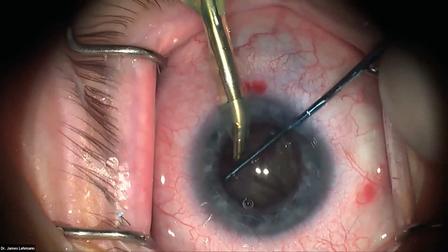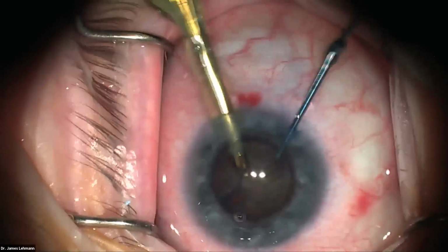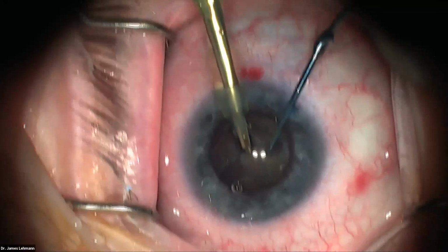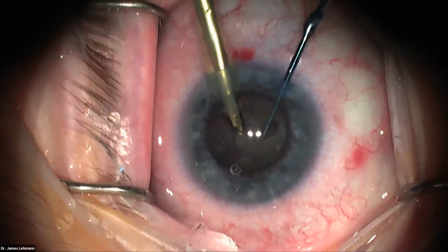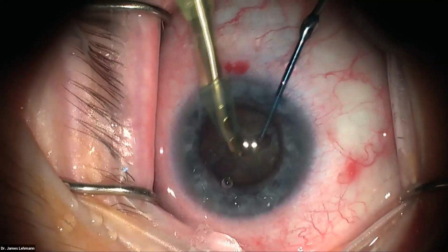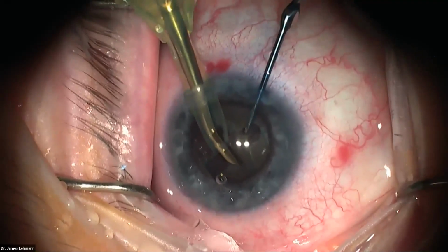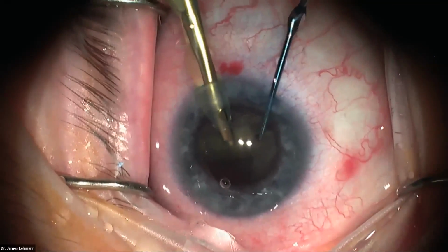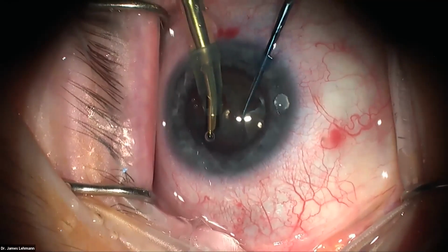Now I only remove quadrants, or I try to only remove quadrants directly away from the phaco handpiece. So I don't want to be grabbing here, I don't want to be grabbing here, because you bring them out in a twisted way, and it can cause the capsule to torque, or you can maybe bring up the capsule with your aspiration. So notice with this phaco handpiece, I'm going to rotate it so I can get the biggest amount of surface area covered. And then I go like halfway down on the pedal, lift it up into the iris plane, and then begin to eat it. Now, so I wanted to go back down, so I'll go back and go get it.